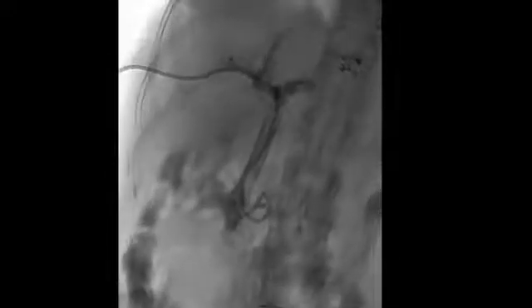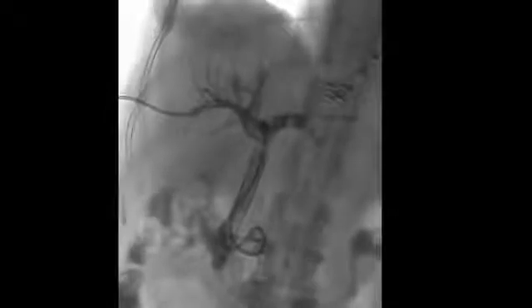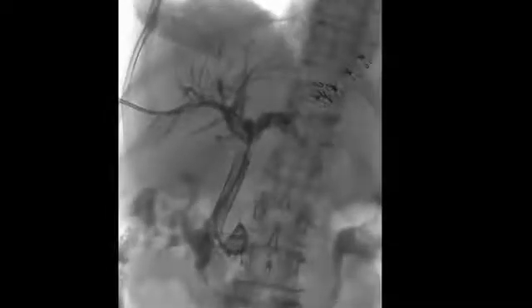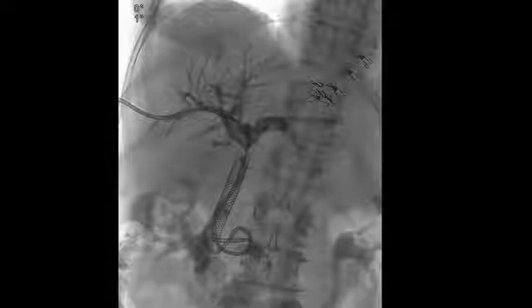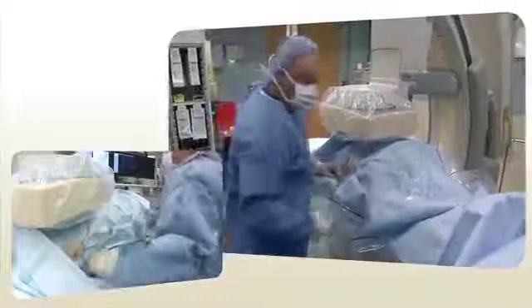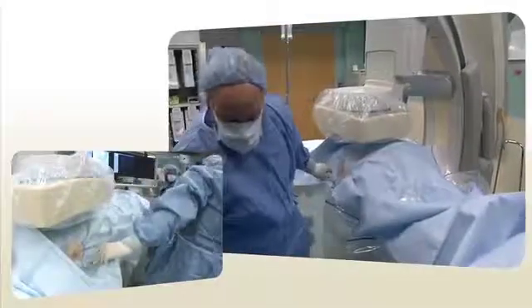Contrast is injected through the catheter and the collection system is visualized under fluoroscopy. The contrast injection reveals several bilomas — small collections of bile — and the presence of a wall stent metallic biliary stent. Note how the biliary drainage catheter was inserted through the interstices of the stent. The biliary catheter was most likely inserted as an internal drain after the metallic stent failed to maintain biliary patency.